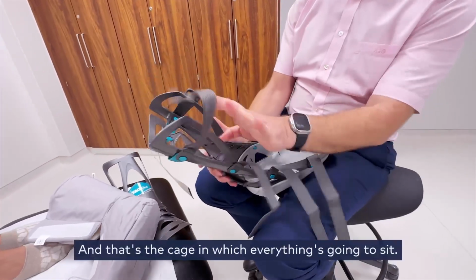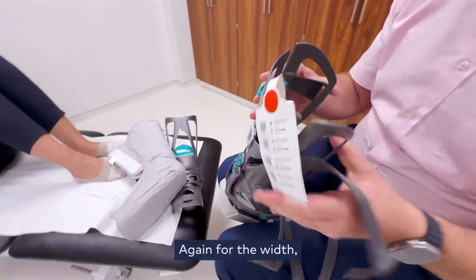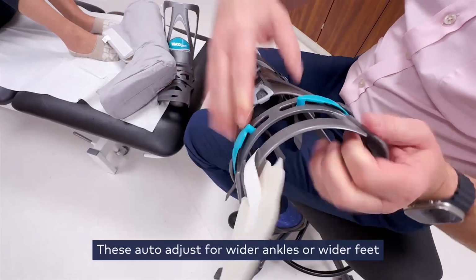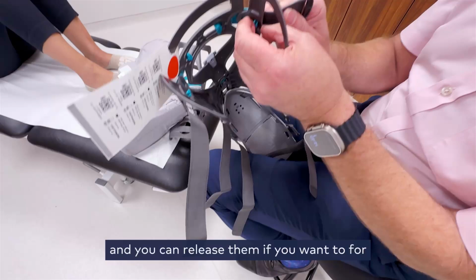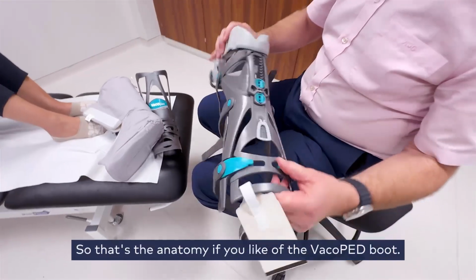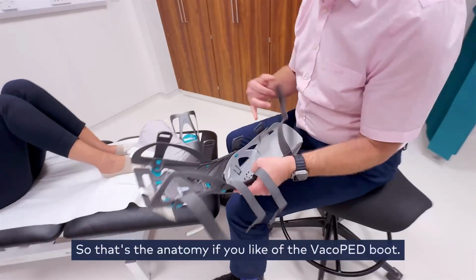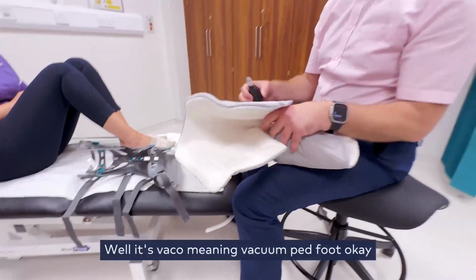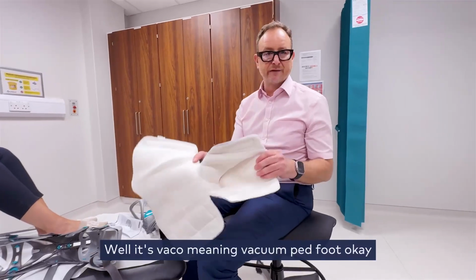And that's the cage in which everything's going to sit. Again, for the width, these are adjustable. These auto adjust for wider ankles or wider feet, and you can release them if you want to for wider sizes. So that's the anatomy, if you like, of the VacoPED boot. Now, why is it called VacoPED? Well, it's Vaco, meaning vacuum, ped, foot.